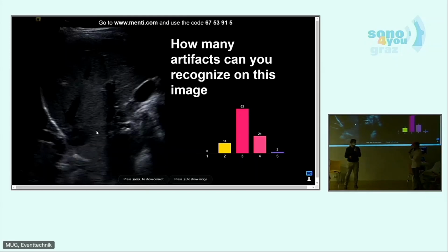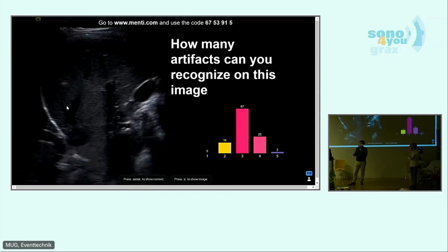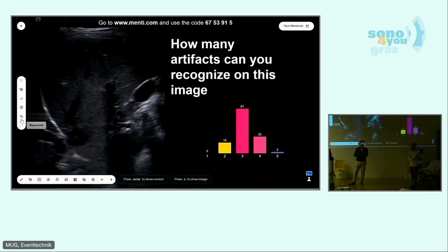It's another hard question, because two artifacts are probably kind of easy for you, since we use the same image for the mirror artifact. And probably most of you also recognized the acoustic enhancement behind the gallbladder. But there are two more artifacts in this picture actually.